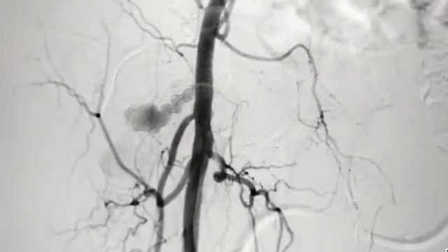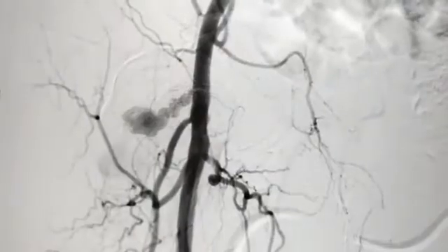Doppler was done and subsequently angiography was done. The angiogram demonstrated there is a pseudoaneurysm coming from the right common femoral artery and going laterally and posteriorly, as well as into pouches of the pseudoaneurysm, and we can see the flow very nicely.